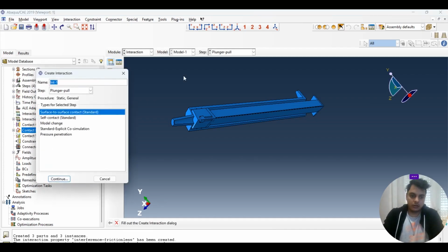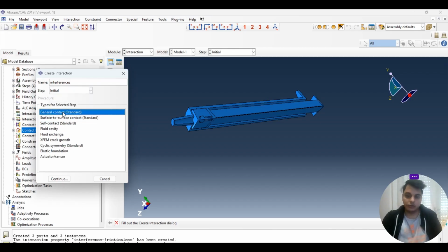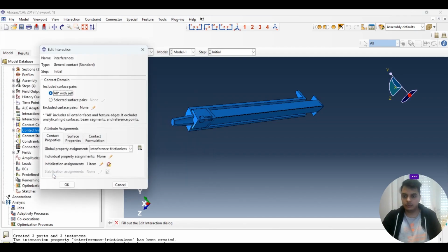So we want it to be defined like interferences. Make sure we apply this to the initial step as a general contact between each and everything. And we just simply go continue, and what we want is all with self, and we want to initiate with the frictionless, and then we also want the initialization, like it is treated as a fit, so we just put it here for surface, and this is good enough.